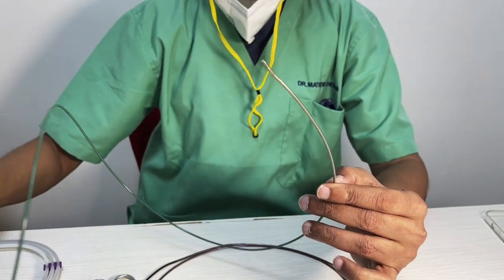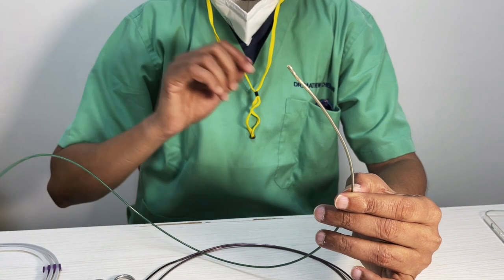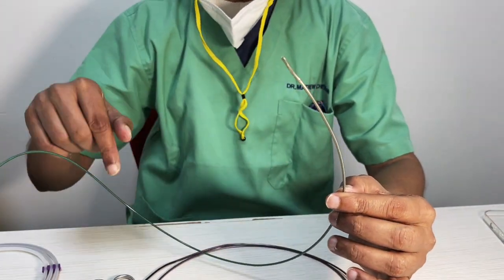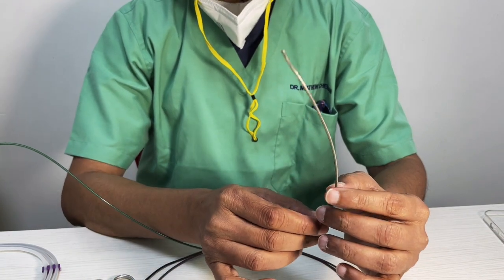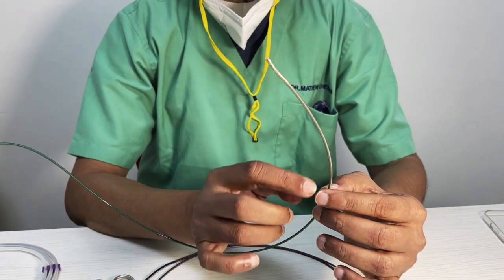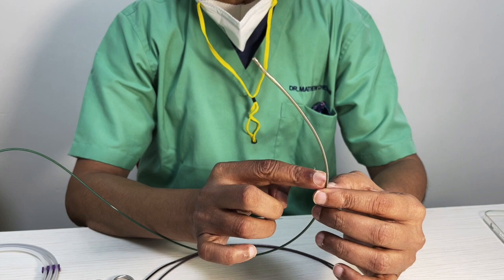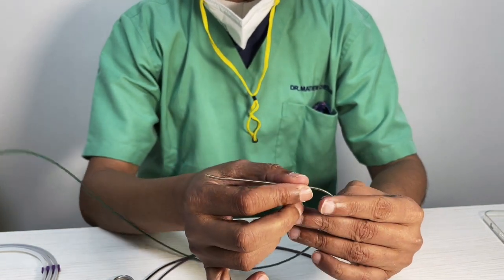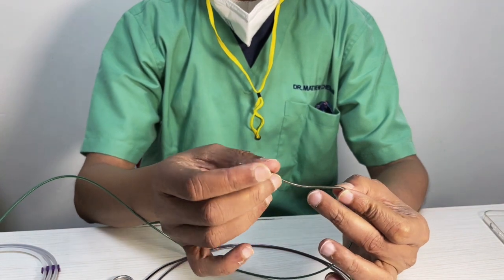So is it a perfect catheter? It is good in many ways. It gives us a very good pushability because it's got a stainless steel spiral running all the way. Its trackability is improved a lot because it has got a spiral loop which allows it to definitely take much better curves. So you can see.